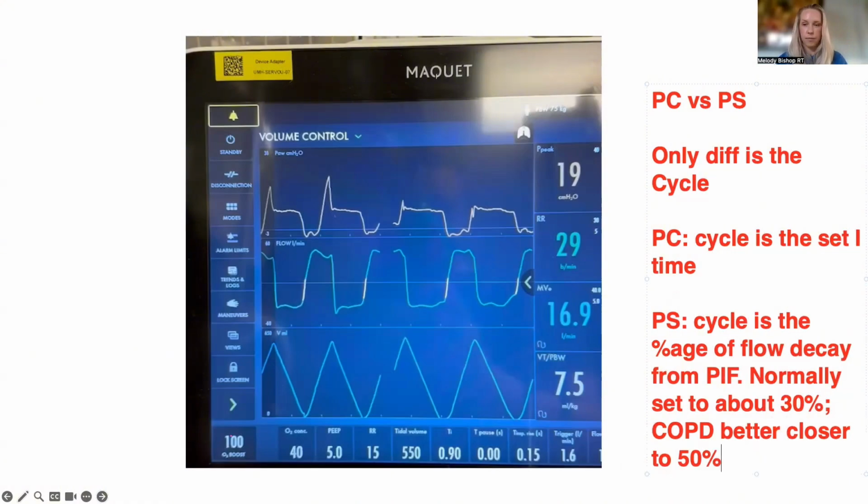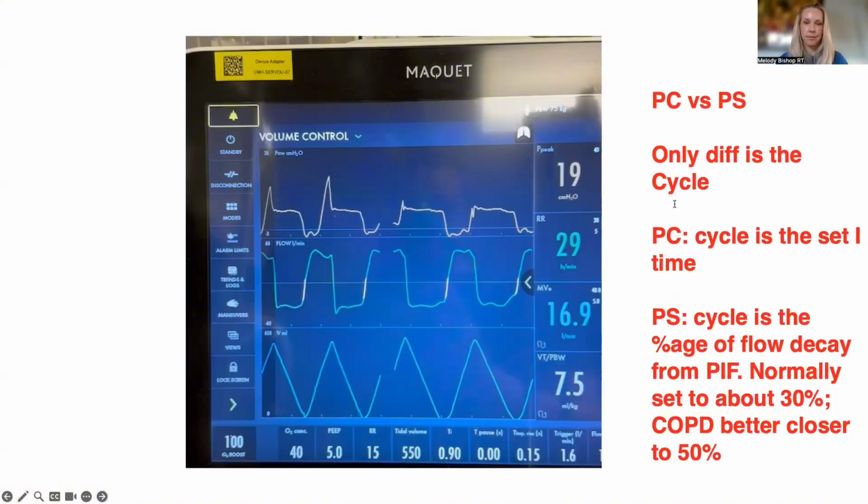Now, Melody, let me ask you a second question. If I have a patient with emphysema who's on pressure support and I set that cycle decay to 10%, what could I possibly cause? You'll end up having cycling dyssynchronies. Like absolutely you will. And cycling dyssynchrony can be present in multiple different ways. I'm definitely going to be hitting on this a lot because I think pressure support is so poorly misunderstood.